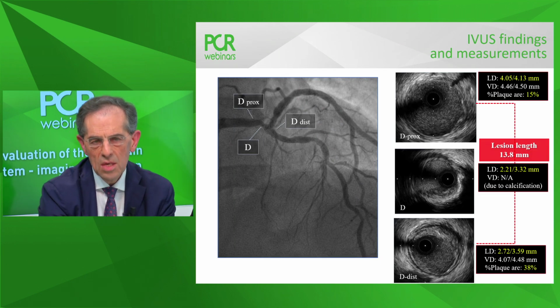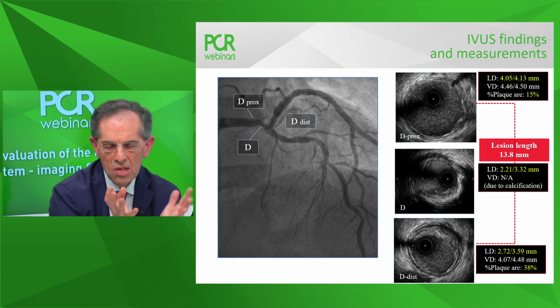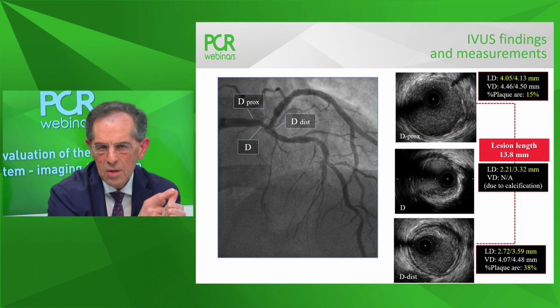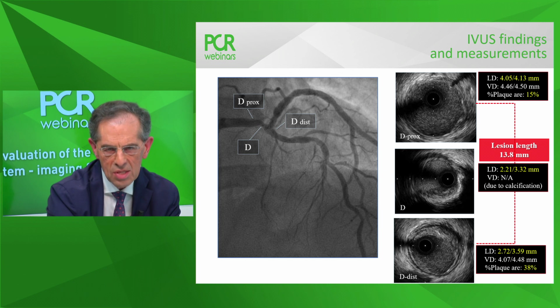so the most important information is not only in a minimum lumen area, but to get the guidance eventually for intervention. You can see 3 clear examples of how we are using IVUS for guiding the PCI procedure. In the upper part, you might see a proximal left main cross-sectional area, where you can see that number 1, there is no plaque. Number 2, the vessel diameter is 4.5. You are going to be guided in the selection of the stent.